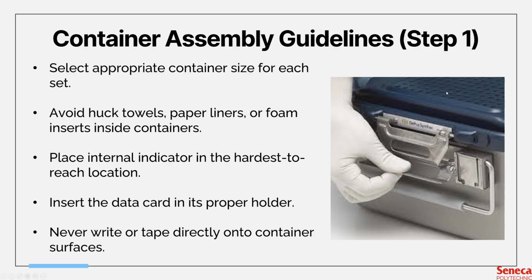So this tray here is actually not a popular one anymore because they tend to break down really quickly. It's to a point where some technicians are even taping these locking mechanisms together so that it doesn't move or get tampered with too easily.